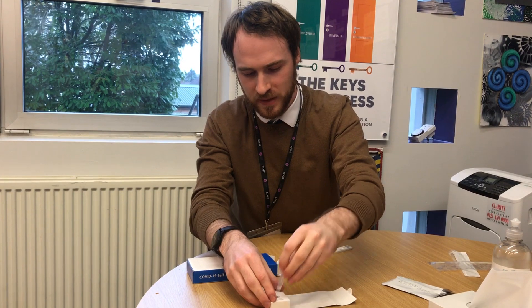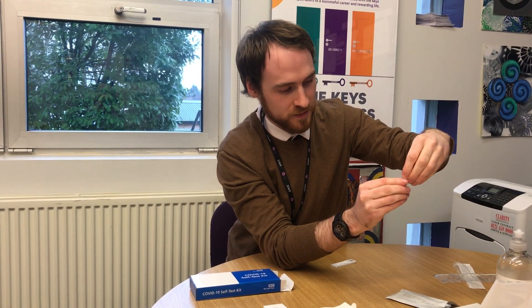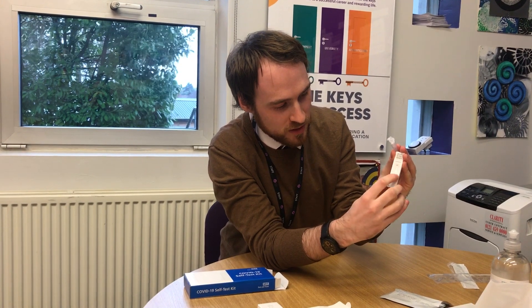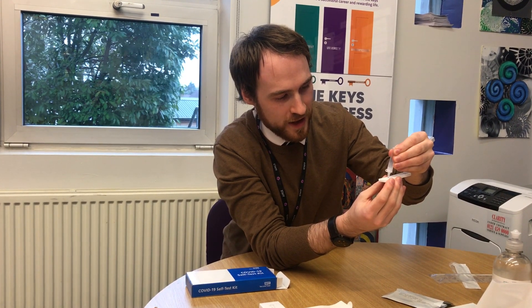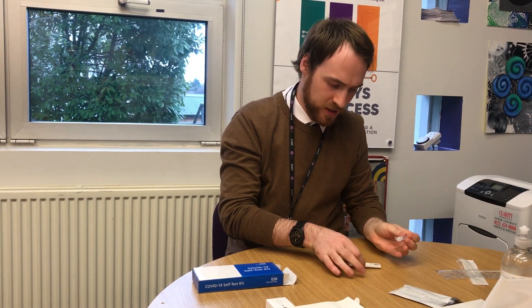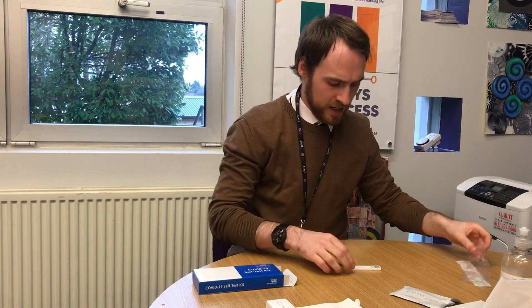Finally, place the cap on top of the vial and return to the lateral flow device. You can see there's a small insignia of an S and a small pressure pad. Just gently squeeze two droplets of the liquid onto there. Once done, leave it on the sanitised work surface, put the swab back into the disposal bag, and leave that for roughly about half an hour.